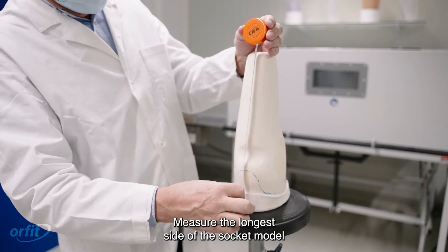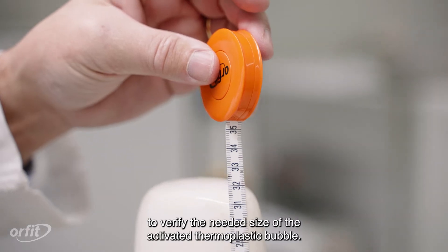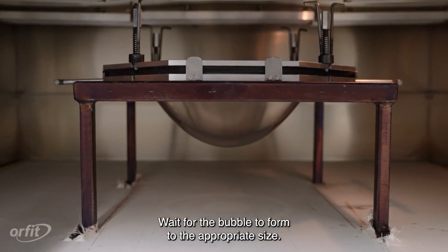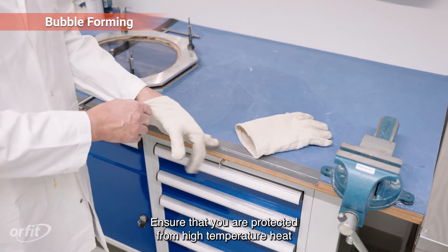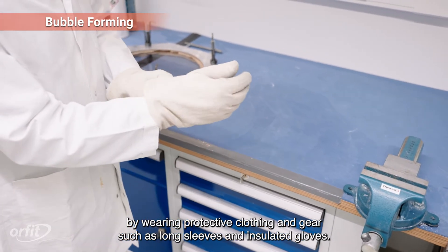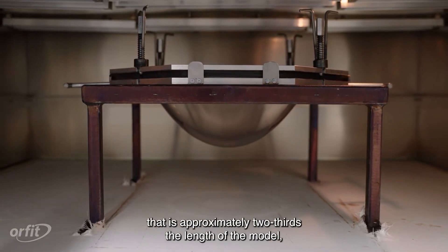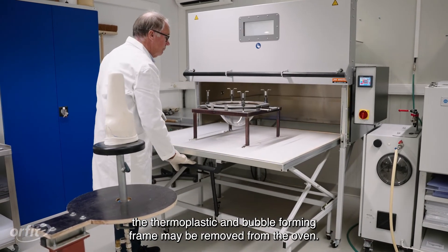Measure the longest side of the socket model, from the trim line to the distal end, to verify the needed size of the activated thermoplastic bubble. Wait for the bubble to form to the appropriate size. Ensure that you are protected from high-temperature heat by wearing protective clothing and gear such as long sleeves and insulated gloves. Once the activated thermoplastic has formed into a bubble that is approximately two-thirds the length of the model, the thermoplastic and bubble-forming frame may be removed from the oven.